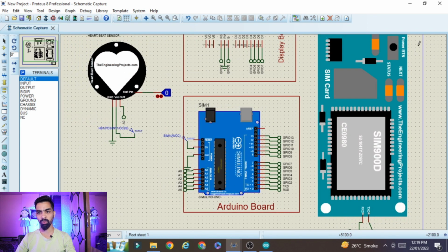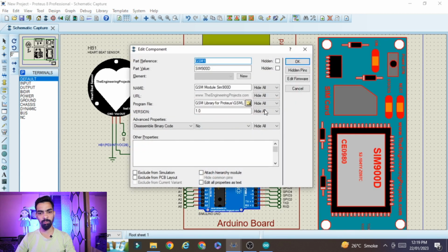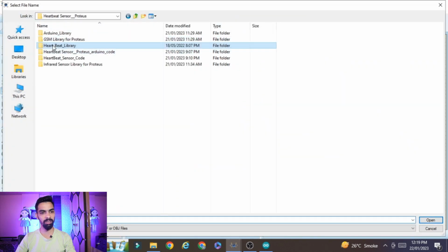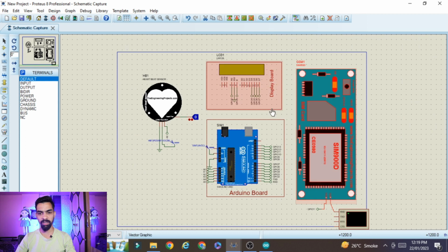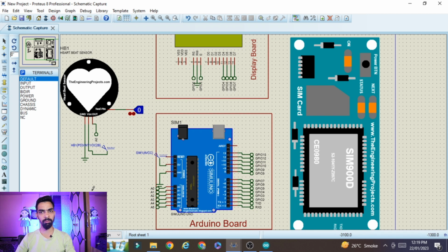Now the next part, you have to load the hex file of this GSM model. So double click on the GSM model, click on the folder, then go to that folder again, and you will find the GSM library. Go to here, select this hex file, click on OK and click on OK. In this way your hardware connection is completed. Now the next part is the programming part, and then we will see how to run my ready-made project if you want my ready-made project.